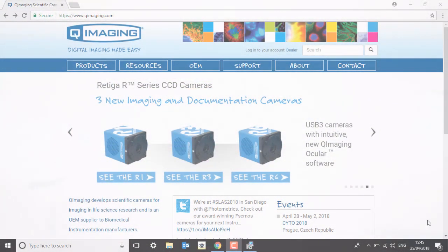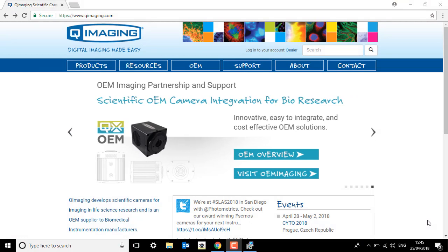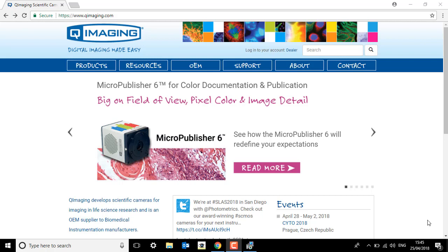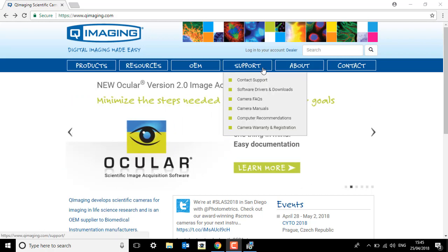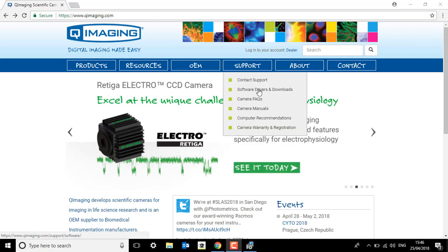So in this video we're going to go through how to download Ocular imaging software. If you head over to the QImaging website, that's qimaging.com, and if you go to the top of the page you'll see this support tab. Just hover over it and you'll see a drop down menu, and the second option down is software drivers and downloads.